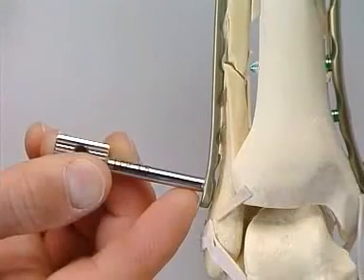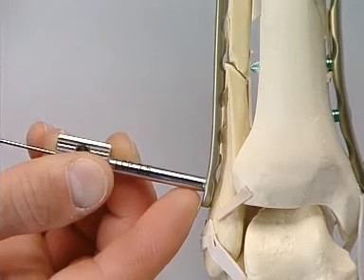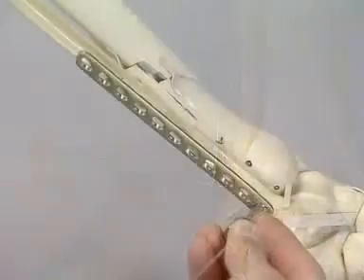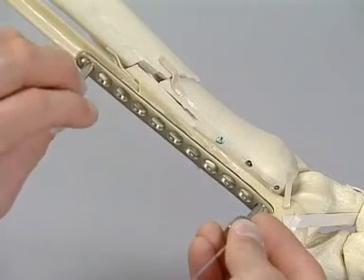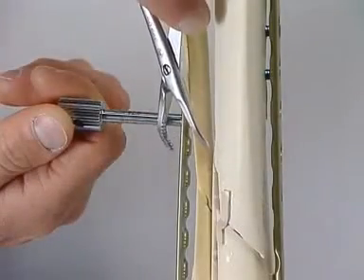In this model, the distal end of the plate is aligned at the level of the upper ankle. Preliminary fixation is carried out with a K-wire inserted through the threaded drill guide. The K-wire should lie as centrally as possible in the fibula. After a further threaded drill guide has been screwed into the most cranially situated hole in the plate, the correct length of the fibula is aligned. In reality, this has to be done by image intensification.